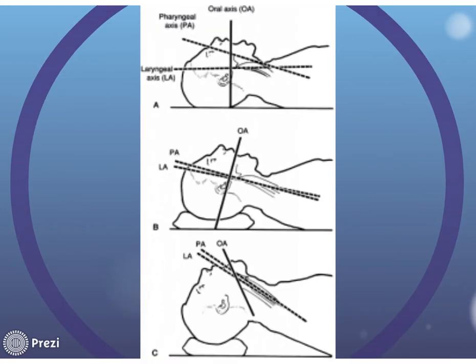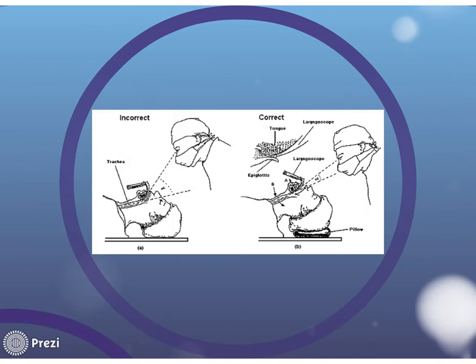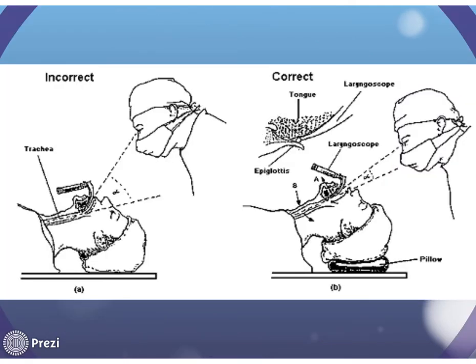So here it's showing you with the DL how things align, and notice that with the head being raised just a little bit, it brought everything into a line. I think you know the basic anatomy in there now, I'm hoping. All right, so the bones, you've got some down here and some over here. Make sure you know those.